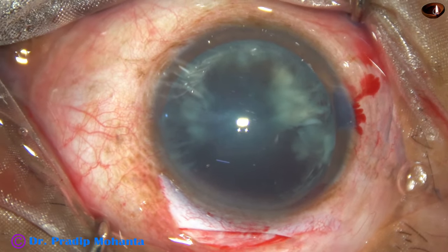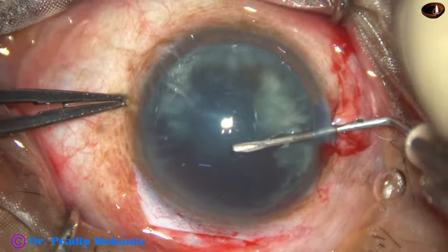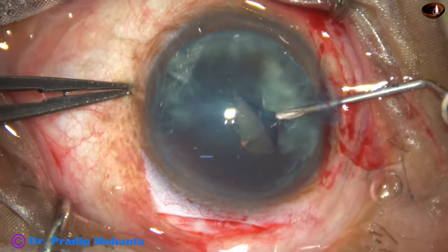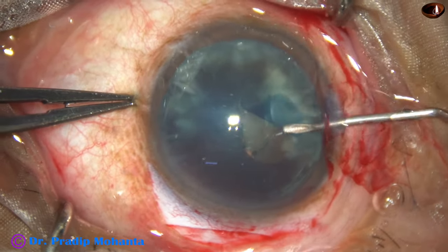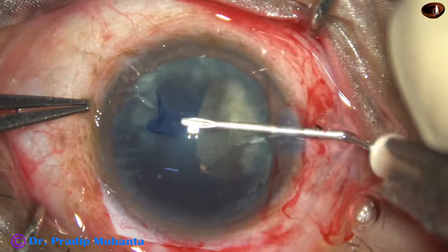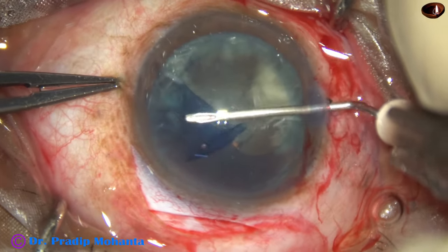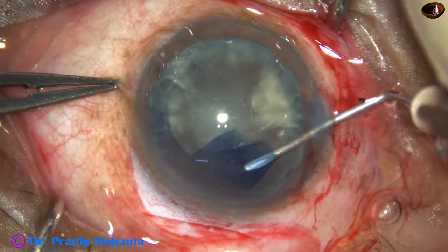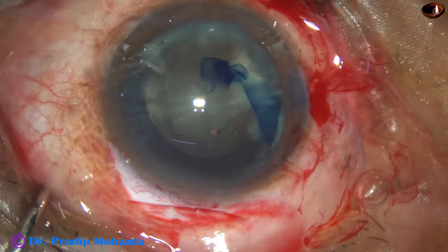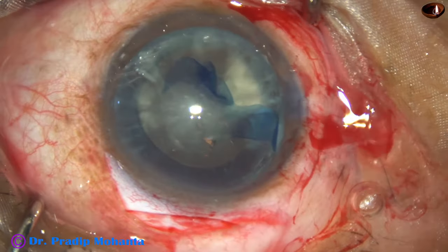And now I am going to do the rhexis with the help of a needle. Go in, make a cut like this and pull it. Now flip this capsule. This capsular tag is guided by the needle, just pushing this flap up to 3 o'clock. And from 3 o'clock I am pulling this flap. And thus I get an adequate size rhexis. This rhexis is about 5.5 millimeter.